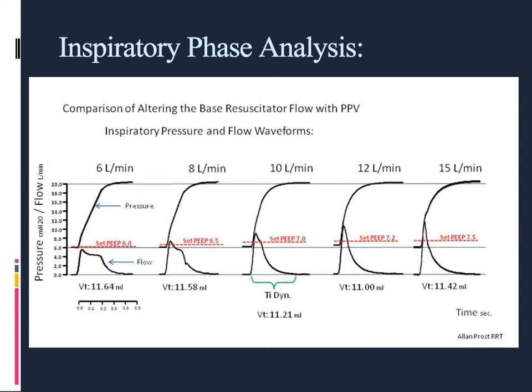So what I'm showing here is that I think I can demonstrate that at very low background flow rates, you get a very tapered inspiratory flow like this, and then when you increase the background flow, not surprisingly, you get a very sudden increase in inspiratory flow and a slow decline as lung and mouth pressures come closer into equilibrium.